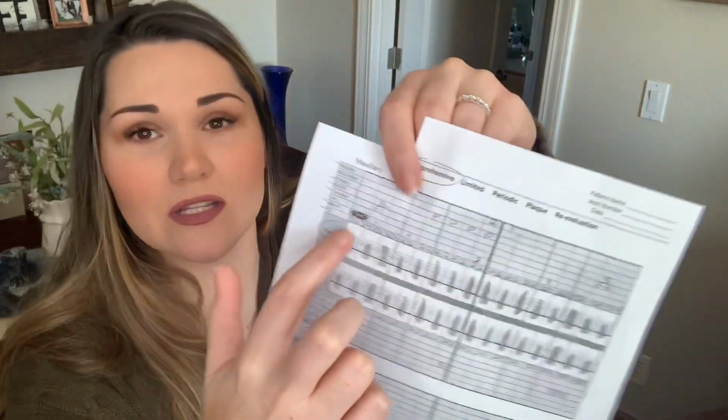I'm actually not quite sure of the highest reading you can have on that. Most commonly it's a 1 to a 3. I have seen some 5s. I actually wonder if it does go up to a 12 like the other readings do. So if you're a hygienist, or if you're an assistant, let us know down below. But that is going to go on your gum recession line.